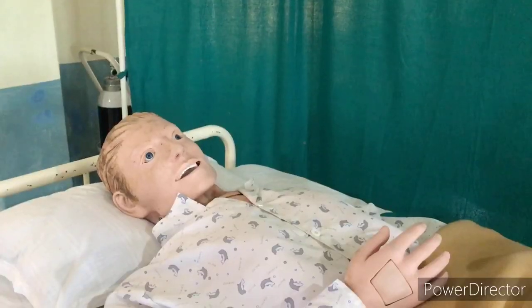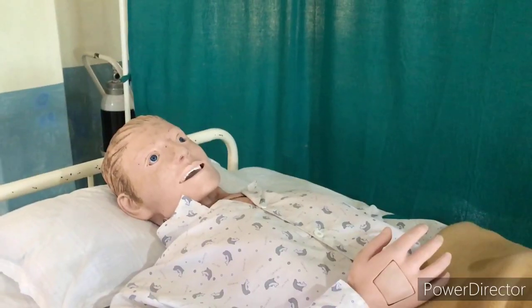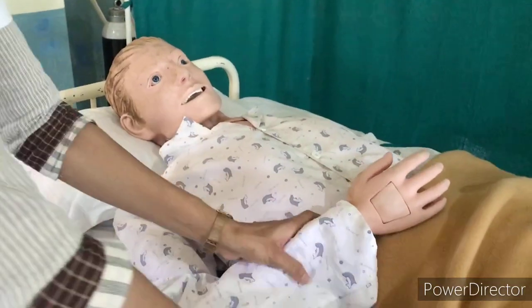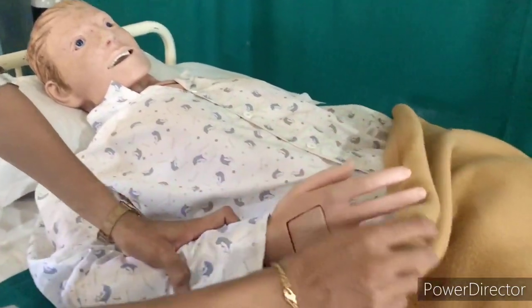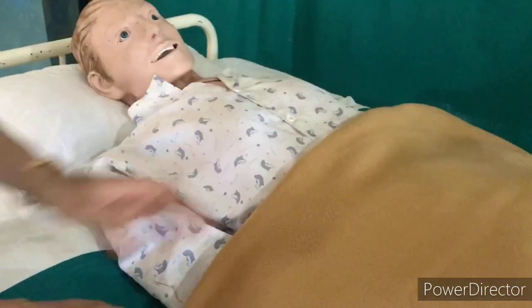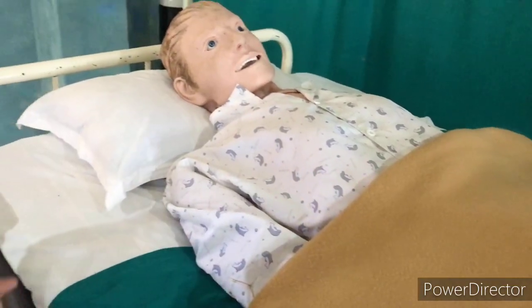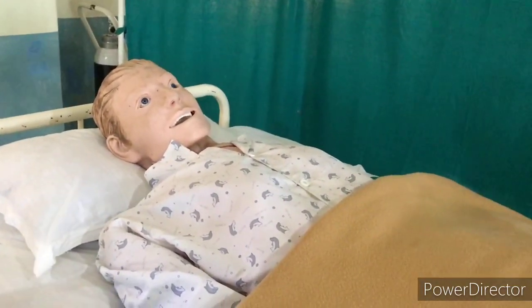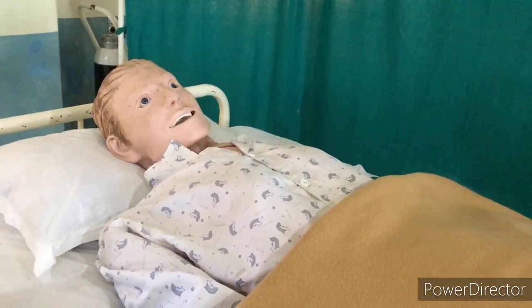After care of the client and articles: Make the client comfortable. Tidy up the unit, replace all the articles, and wash hands.